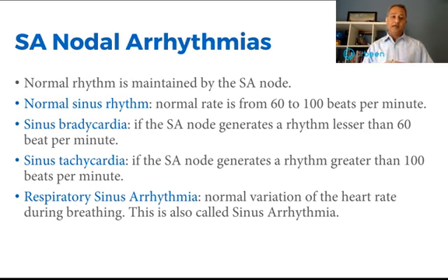Now what is bradycardia? Sinus bradycardia. So the SA node is working. The SA node is responsible for creating the impulses, but the impulses are below 60. That is the definition of sinus bradycardia. There can be bradycardia which is not sinus, meaning the SA node is not working and some other part of the heart is working and the impulses are low. So please remember to call it sinus bradycardia.